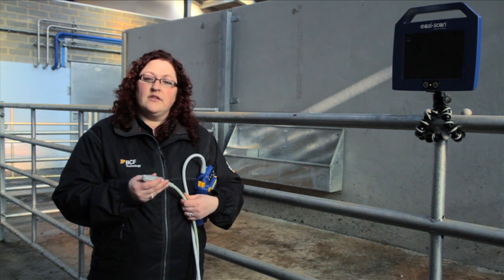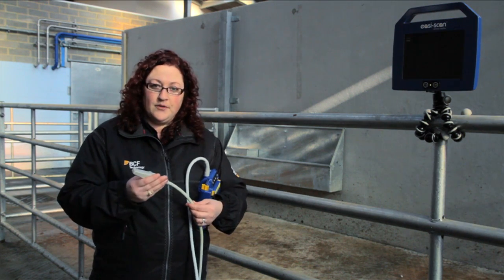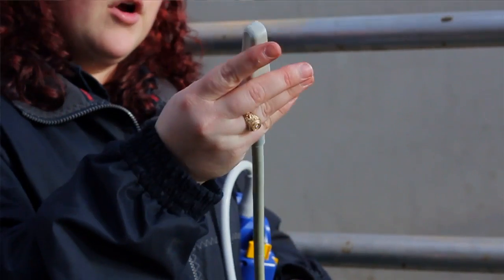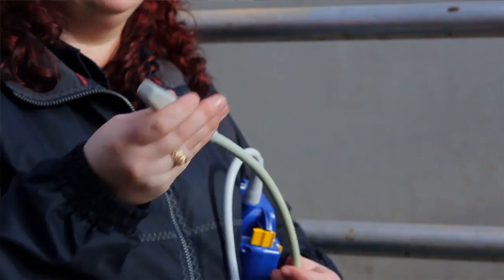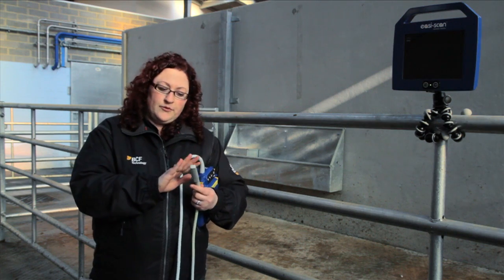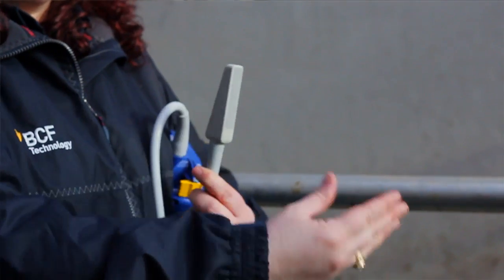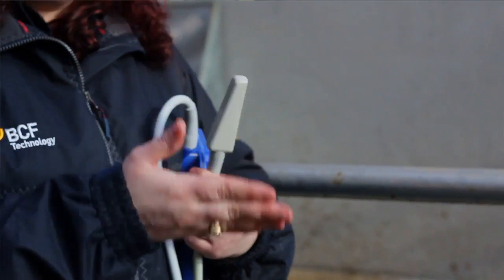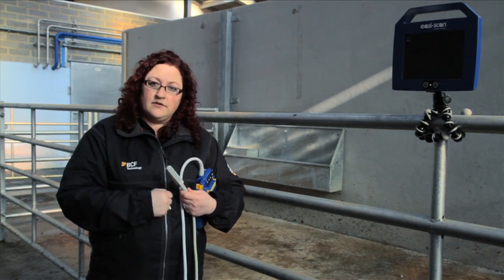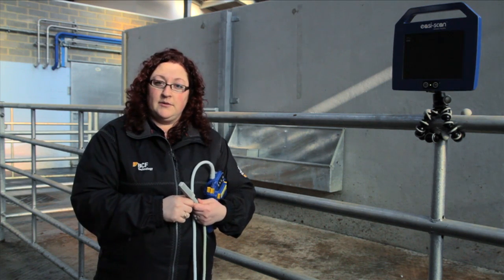Next we will be looking at the next component of the ultrasound machine setup, and that is the probe. We've already looked at the console, and now we will be looking at the probe, which is the actual information-gathering device of the setup. The probe is what actually goes inside the cow and releases ultrasound waves, which will then interact with the tissues within the cow, send back a signal to be recorded by the console, and ultimately give us an image.